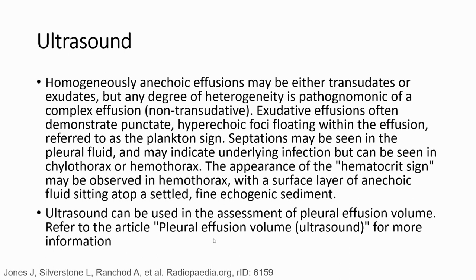Homogeneous anechoic effusion may be either transudate or exudate, but any degree of heterogeneity is pathognomonic of a complex effusion. Exudative effusions often demonstrate punctate hyperechoic foci floating within the effusion, referred to as the plankton sign.